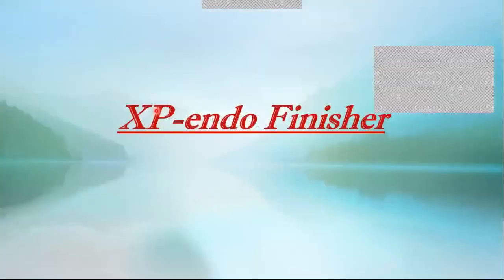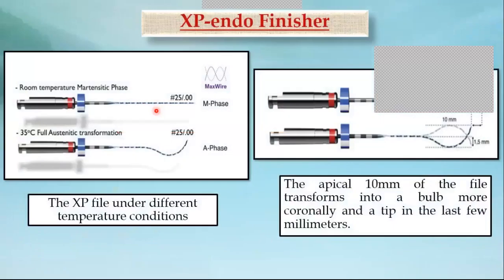What about the XP Endo Finisher? The XP Endo Finisher adopts the Max Wire technology like the XP Endo Shaper. It has a tip size equivalent to size 25 and a 0% taper throughout its length. At room temperature, it has a straight shape, as we can see here. When inserted inside the canal at body temperature, it acquires its unique spoon shape at the last 10 millimeters of the file, with a depth of 1.5 millimeters.